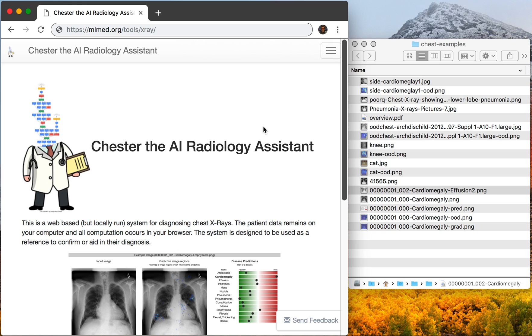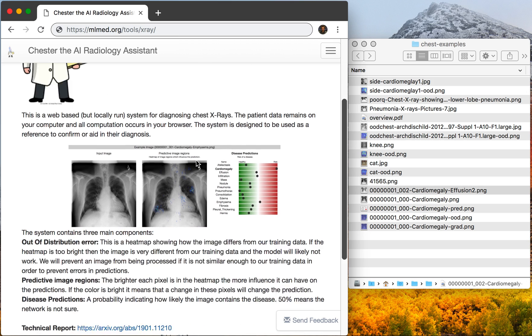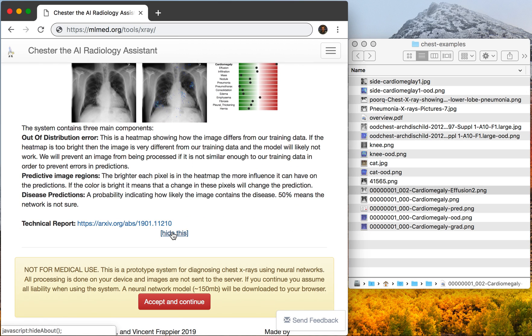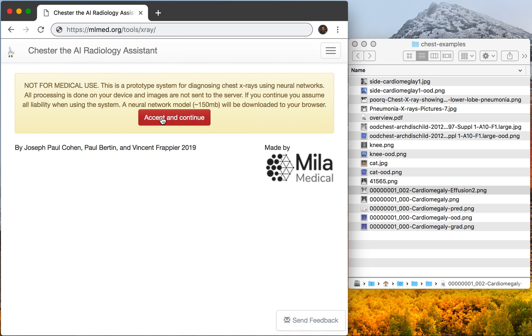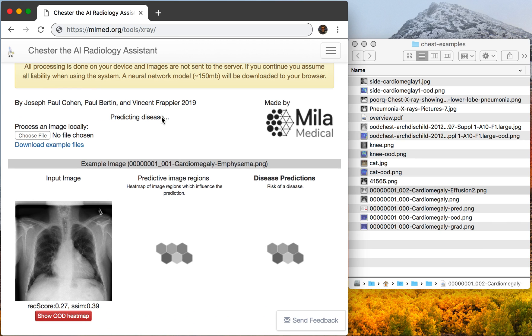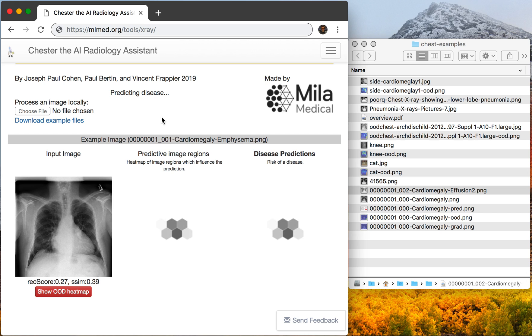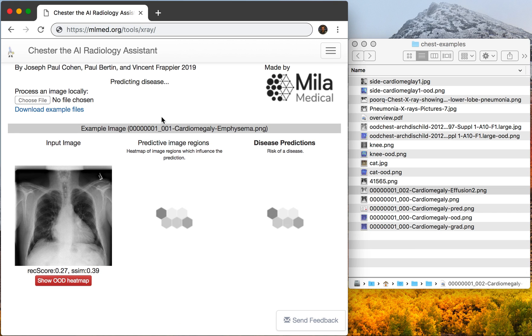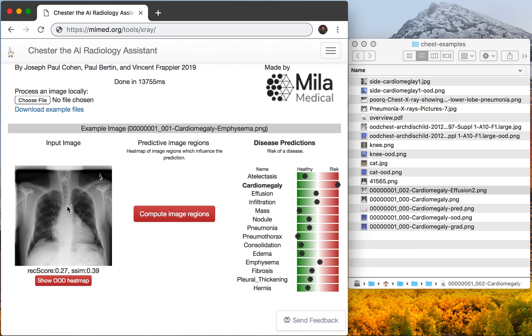I'll go over the basic elements of this system. If we scroll down on this page and accept that we acknowledge this is not making a correct diagnosis — this is an experimental prototype tool that has not been verified yet — we see the input image on the left, and on the right we see the predictions over 14 diseases.